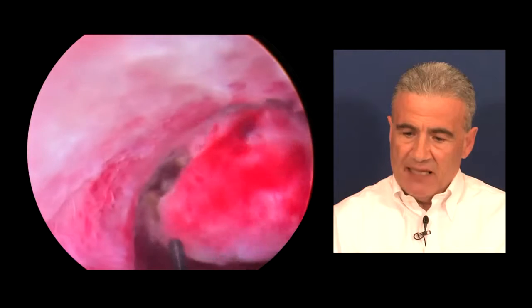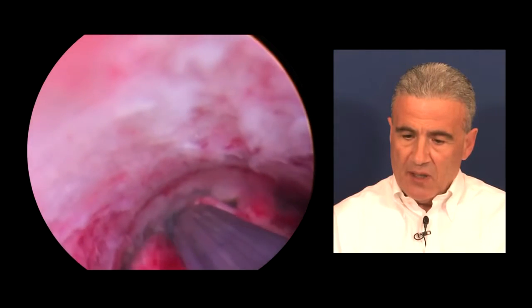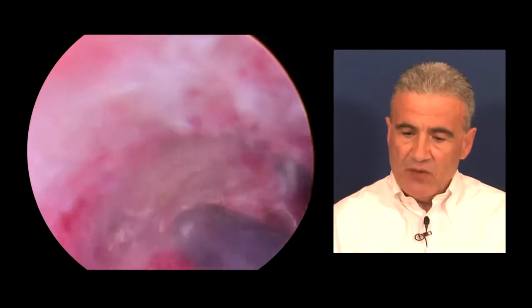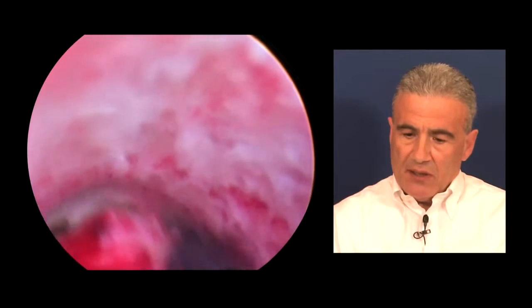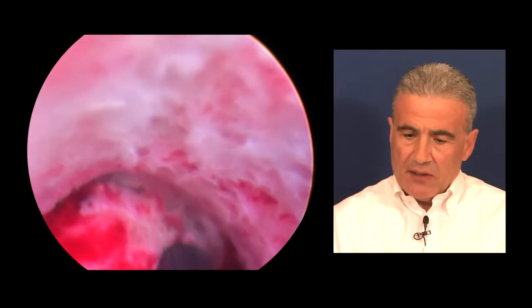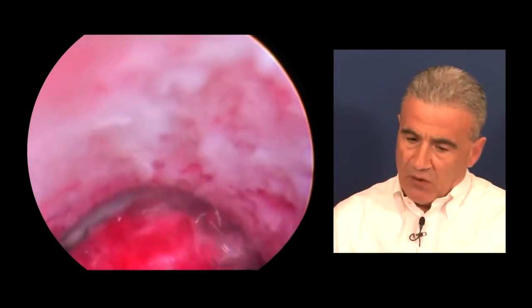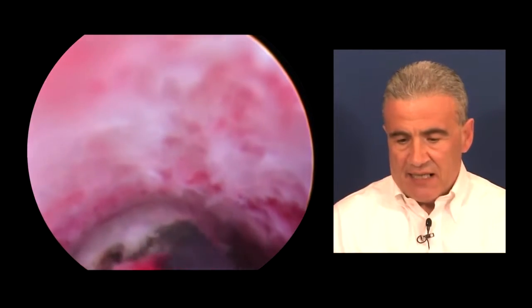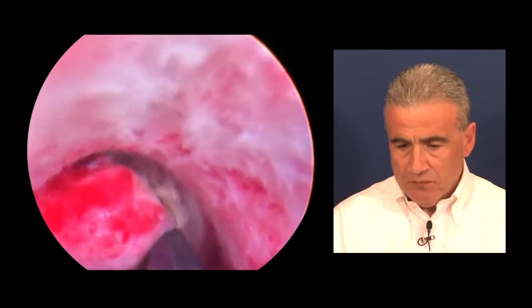We observe the progressive sectioning of the base, which is carried out carefully. And we will see that in a few moments, the base will be sectioned almost completely until only a small area of anchorage of the polyp is left in the uterine wall.